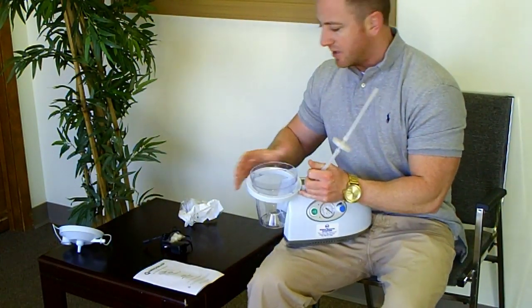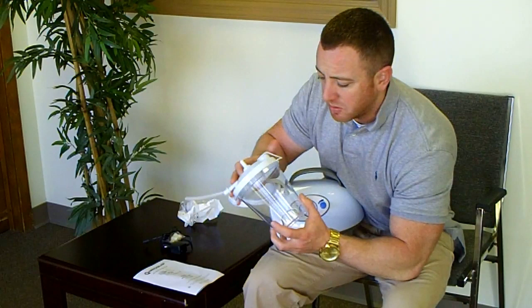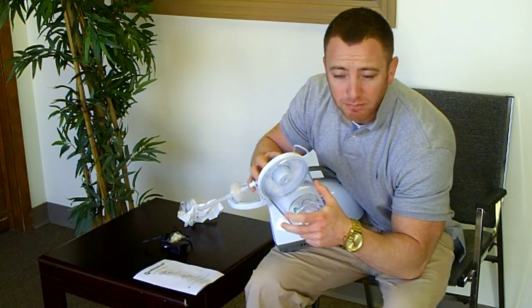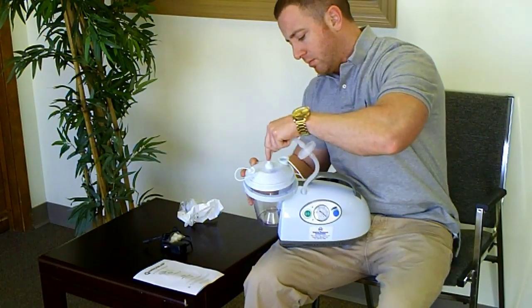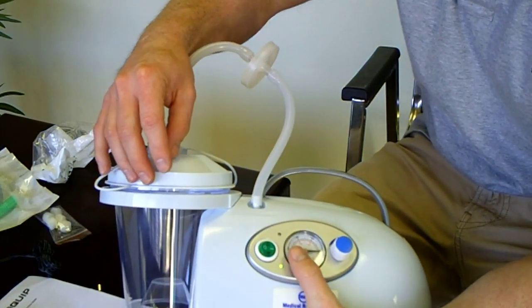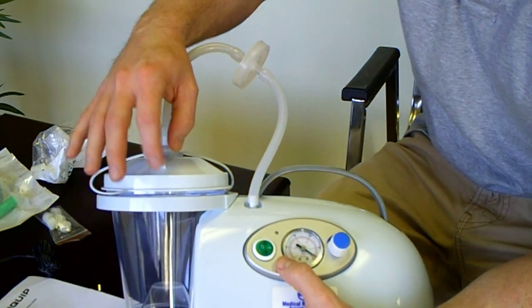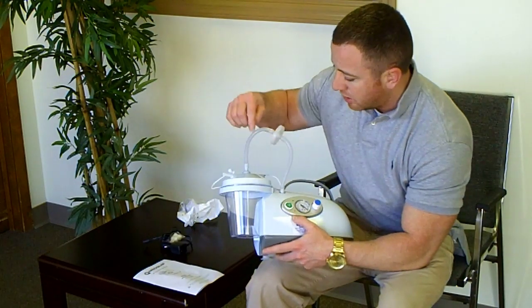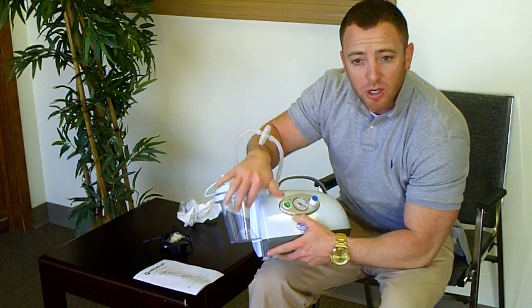The next thing that goes on is your canister. You're supposed to clean this after each use with mild soap and water. After you're done cleaning it, you could put a little bit of mouthwash in there to keep it clean and sterile. Next place you would check it would be here. Now it's going to take a little bit longer to go through because it's having to pull through more air. But once again, it should pull your finger in and the gauge should go up. If it does not suck good there, you either don't have this piece on the canister, or your lid's not on your canister good, or you have a crack or hole in your canister.